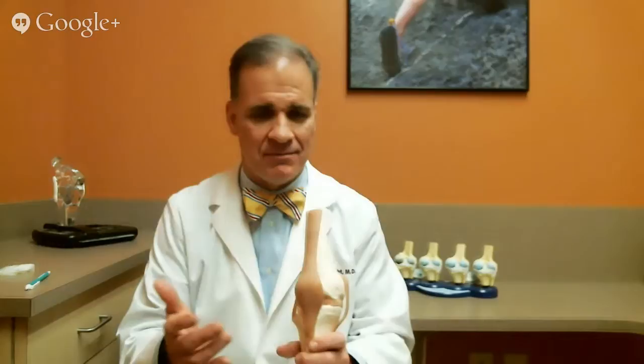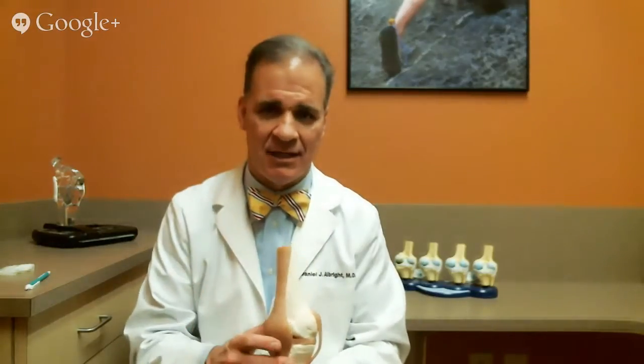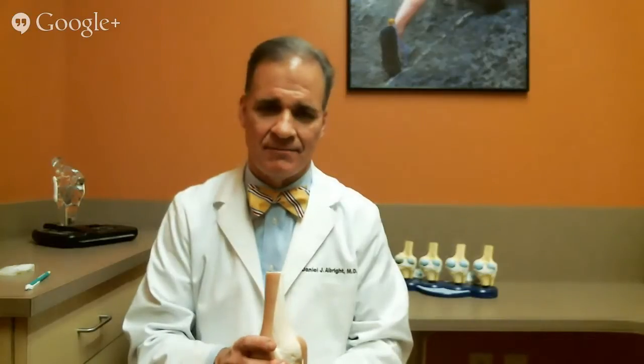It's really important to get the proper tension or tightness and balance the ligaments, and the knee should be straight. A lot of people have a crooked knee when they start — bow leg, knock knee, crooked leg. When you're done, your knee is straight and should move almost fully. Those are the main points about how to do a knee replacement.